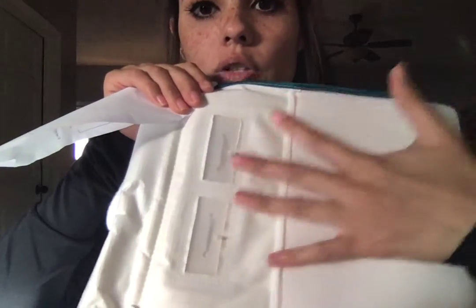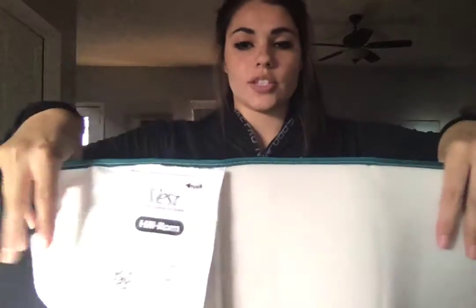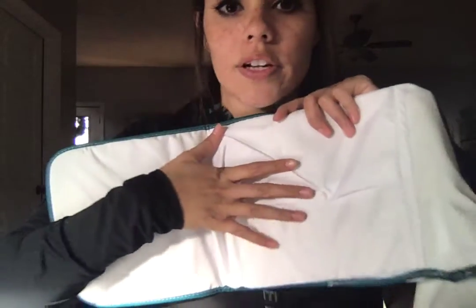You'd hook that up, and then this is just going to lay flat like this on their chest, and then you can secure it. As you can see on the side that lays on their chest, it's going to inflate with air and then vibrate.